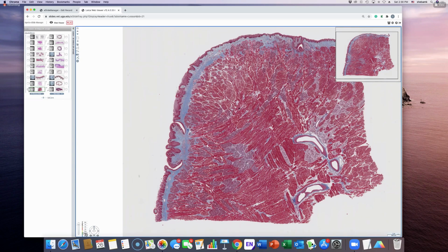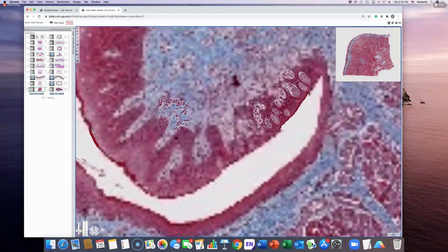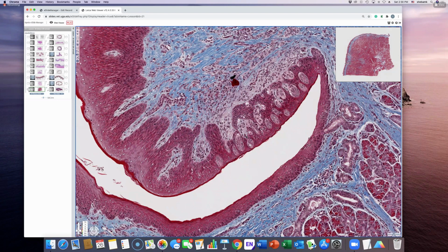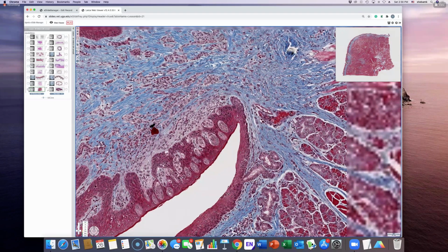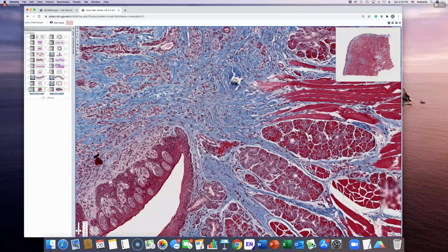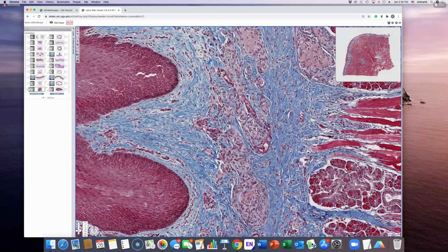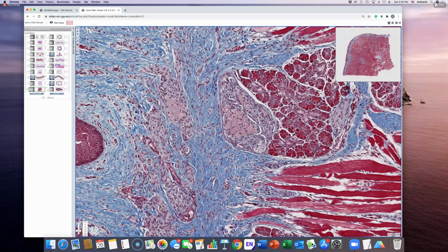So are these gustatory or not? Yes. They are gustatory, because they have these taste buds in them, same kind of cells. So all these are the axons coming from those sensory neurons. They are running down here, and you'll probably see they are crisscrossing, probably connecting with an autonomic ganglion right here. Can you see it? See more autonomic ganglion, another autonomic ganglion right there.